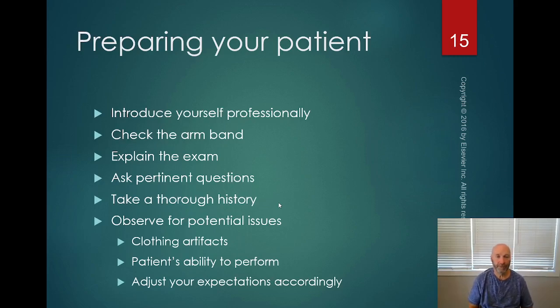So when you prepare your patient, the first thing that you want to do is introduce yourself professionally. Call out the patient's name. Once the patient stands up, introduce yourself. Tell them who you are, what department you're with, and tell them that you're going to take an image.